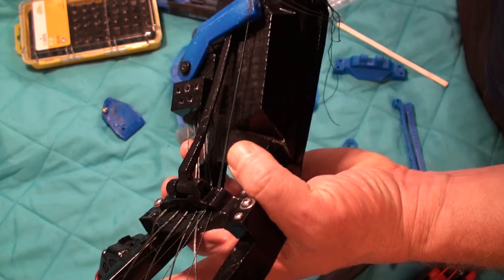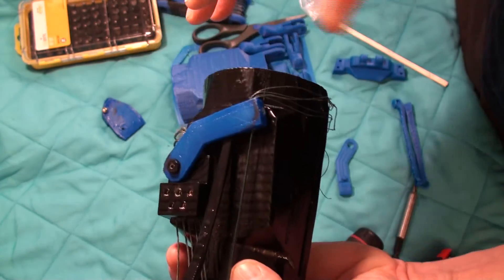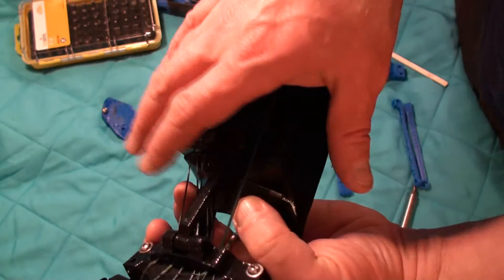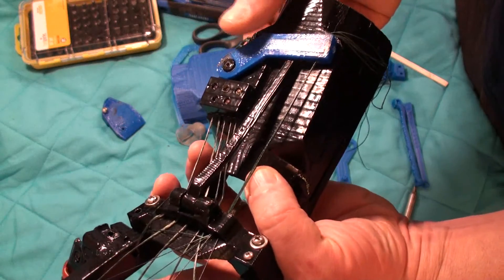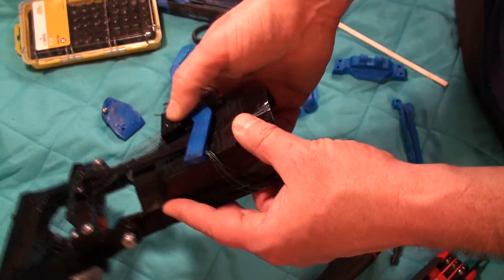The other thing would be it'd be nice to make it less bulky so that it lies flatter on the arm — give it a lower profile.